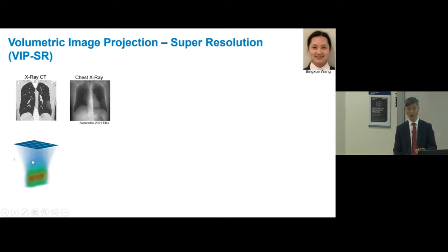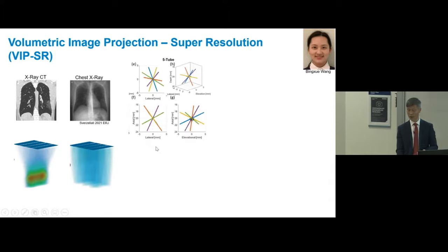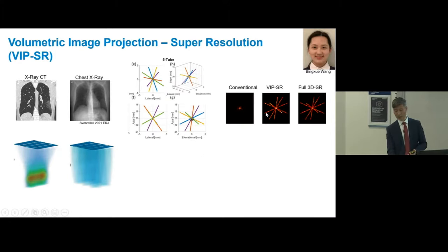Currently, if you're doing 2D ultrasound imaging, you focus the beam into a kind of slice, right? So that's what we do. But here, the idea is we don't do focusing. If we don't do focusing, then you're sensing the whole volume under the transducer. Of course, your signal will become a little bit not as good, but we can do post-processing to recover that. Also bear in mind, we're doing super resolution, so there are single scatterers in there for us to look at.